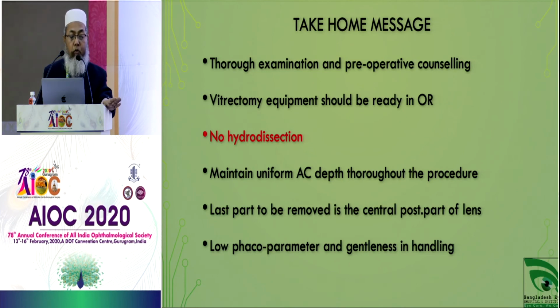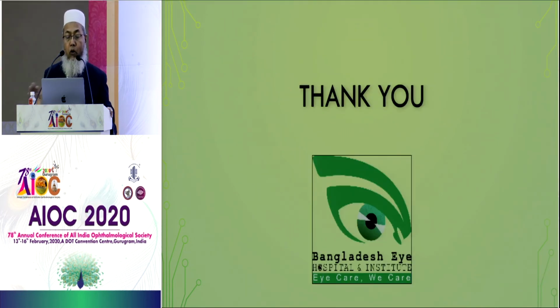Thorough examination and preoperative counseling is very important. Vitrectomy equipment should be kept ready, and there should not be any hydrodissection. Maintain a uniform AC depth throughout the procedure. The last part to be removed is the central posterior part of the lens, and low phaco parameters and gentleness of handling is mandatory. Thank you for your kind attention. Thank you.